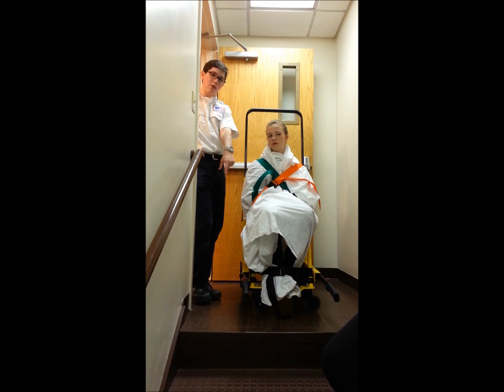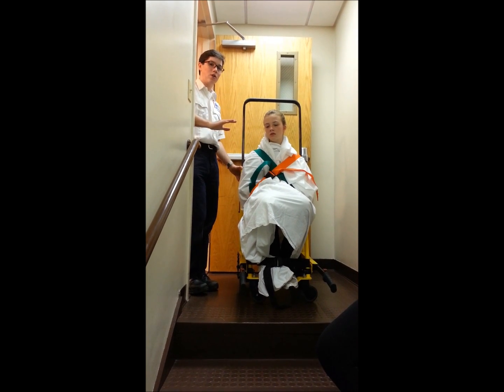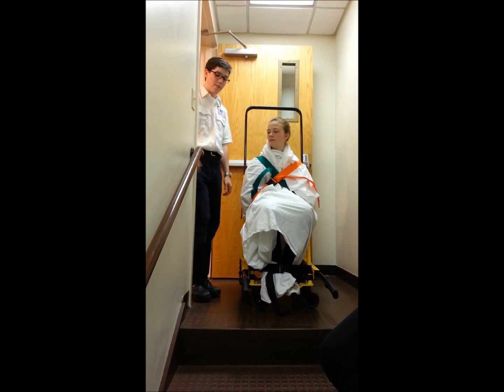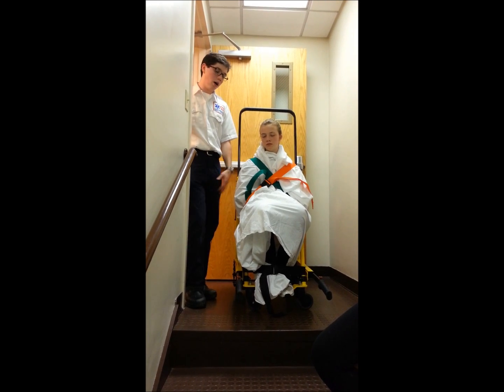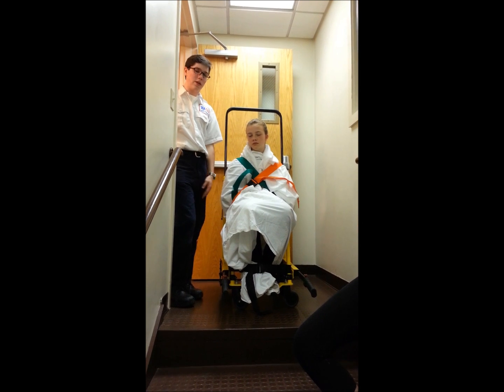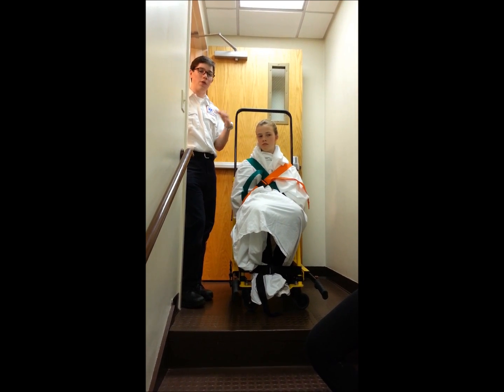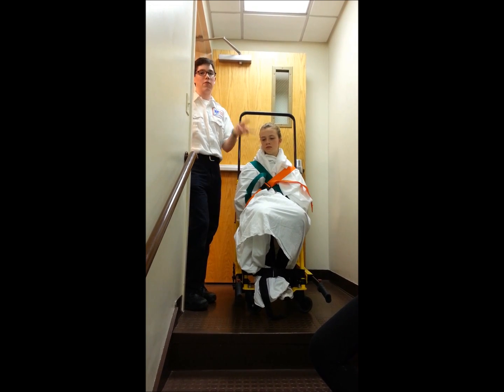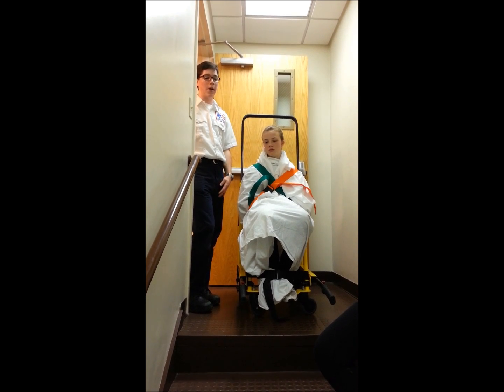As the person down there, you're going to be using those two handles to tip the patient back and make sure that the treads actually catch. You're going to be guiding each of the treads as it goes, making sure that the treads hit the corner of the stair. As the spotter, you're going to have your hand on the back of the person holding down below, putting pressure on them to make sure they don't fall back, and also guiding them — telling them what steps are there, if there's a turn in the stairs, and how many steps they have left to go.